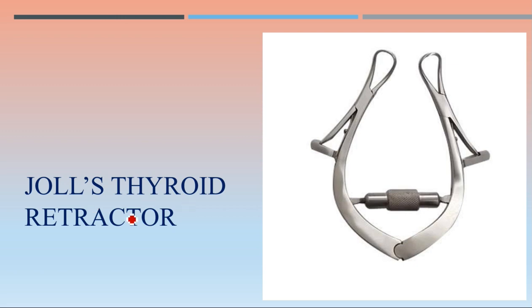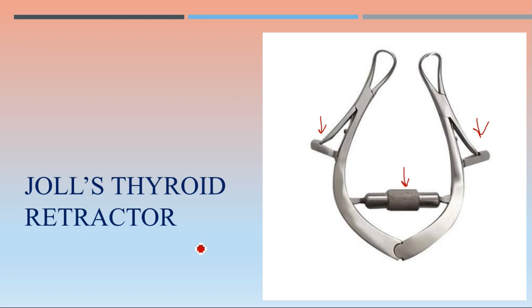Then Joll's thyroid retractor — as the name suggests, used to retract tissues during thyroid surgery. The lock can be released from both sides, and with the help of a knob you can adjust the distance between the retracted parts. This is Joll's thyroid retractor.